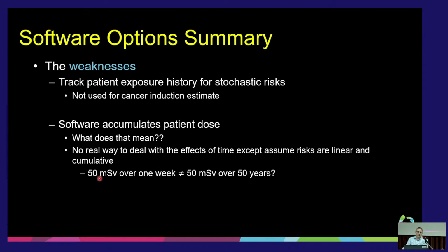We'll explain that in a minute, but as just a quick example, we know CTDI-vol for CT is not patient dose. It collects that data because it came off the scanner, so we can't necessarily say this is the patient dose. And that can be kind of scary, because it'll list patient name, exam dose, and now we just say, oh, this is patient X, Y, and Z's dose.